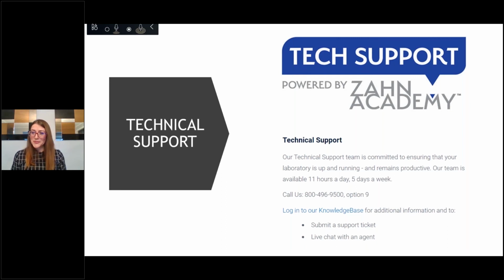Thank you, Elona. We do have a few questions. So the first one I have is, can I do this with any version of 3Shape? Okay, so I briefly covered this, right? So the VPN connection can be done with any version of 3Shape. Again, I strongly recommend that you stay as current as you can, but it can be done with any version of 3Shape. As far as some of the automations that I mentioned, majority of them can be done, but definitely go into the locations that I mentioned and check or contact support and see what other options older versions of software have as far as automation of the workflow or cleanup goes.